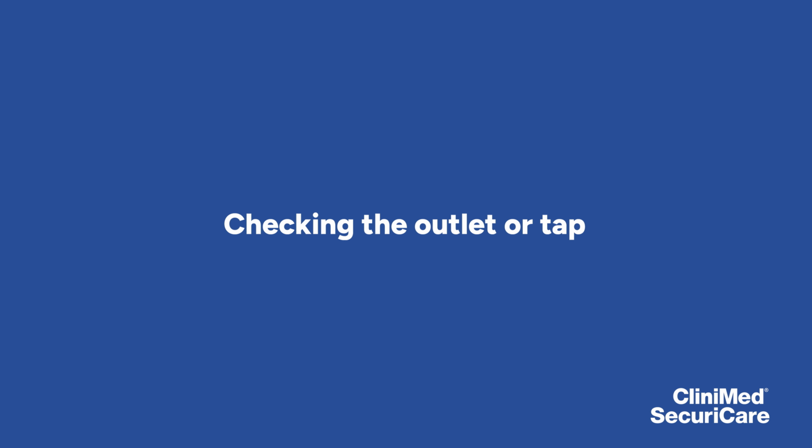Once your skin is clean and dry, you're ready to apply a fresh pouch. Make sure your new pouch is already cut to fit your stoma, whether you've done this yourself or your delivery company has cut it for you, or you're using a pre-cut pouch that matches your stoma size. If you're using a drainable or urostomy pouch, it's important to check that the outlet or tap is securely fastened before applying the pouch. This helps prevent any leaks as you put it on.